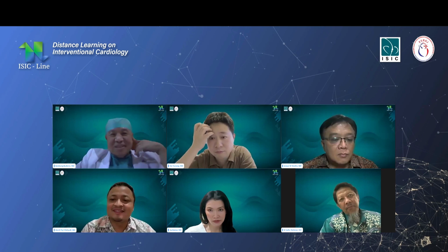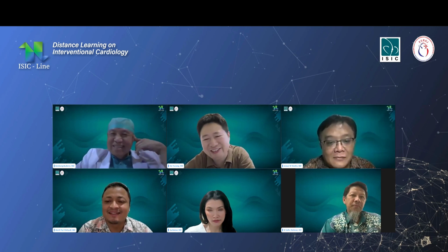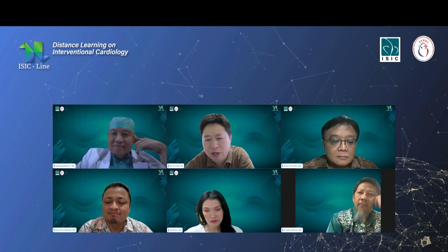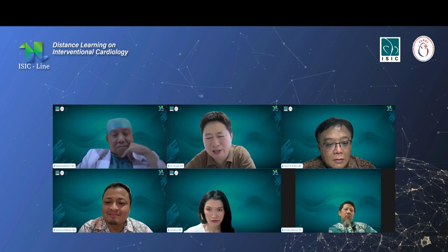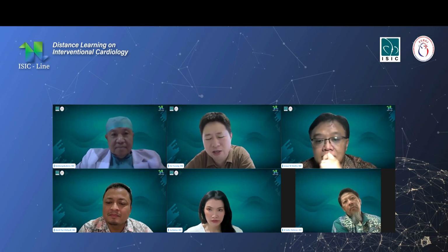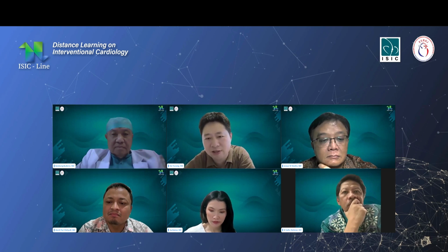Thank you. Please, Prof. Yuxiang, very interesting questions from Dr. Dendy. Yeah, thank you, Dr. Dendy. I appreciate your very meaningful questions. Inflammation is a very important reason for restenosis, as we know. And just as Januar mentioned before, the more thickness, the more inflammation. The current generation of BRS is 160 micrometers. It's very, very thick. So we admit that the inflammation is more severe than with some thinner structures or DES.